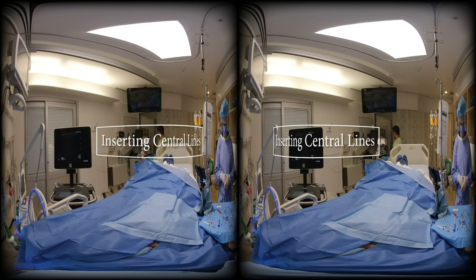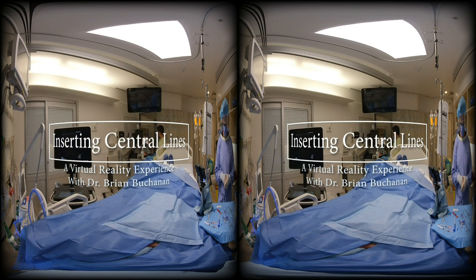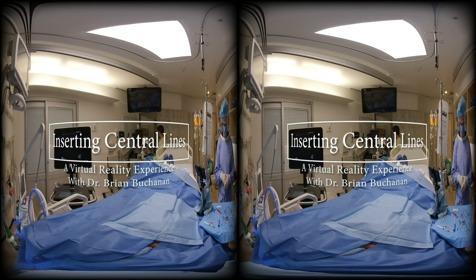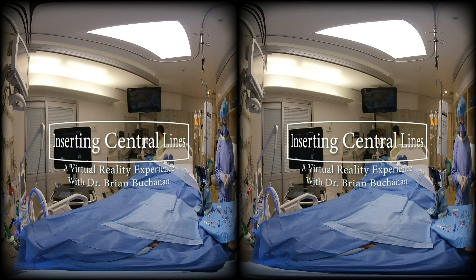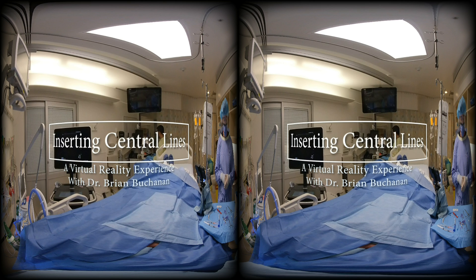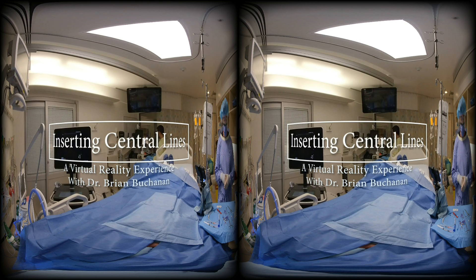Hello there, this is Dr. Brian Buchanan. I'm an intensive care physician at the University of Alberta Hospital. I want to welcome you to this tutorial. Today I'm going to be with you as I walk you through the process of central line insertion.